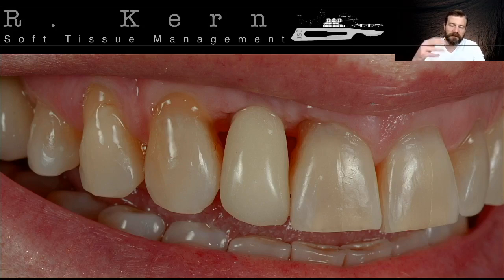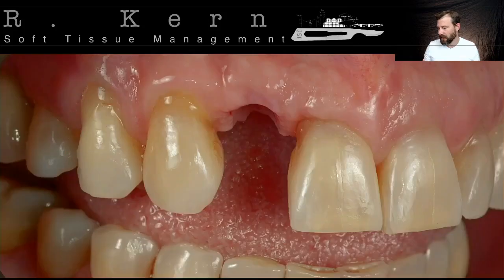Okay, I'm going to explain the strategy and the reasoning behind the decisions taken. We're going to propose for the patient 2 surgeries, only with a soft tissue graft in 2 different stages, to try to reach all the level of soft tissue contour that we need for an aesthetic treatment for this patient. So first thing, we're going to remove this crown.